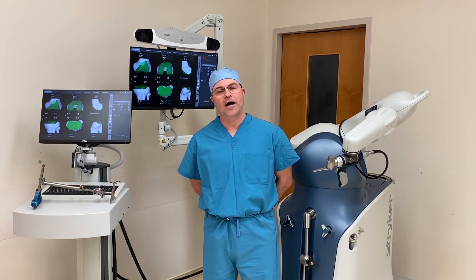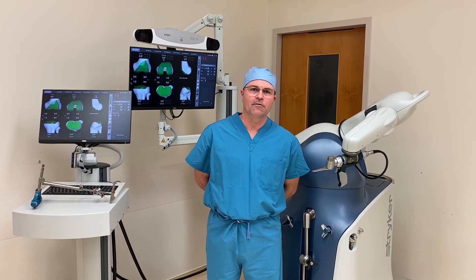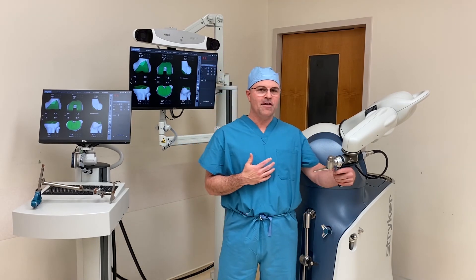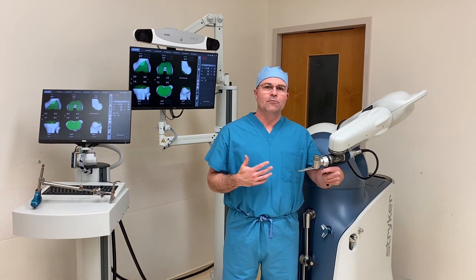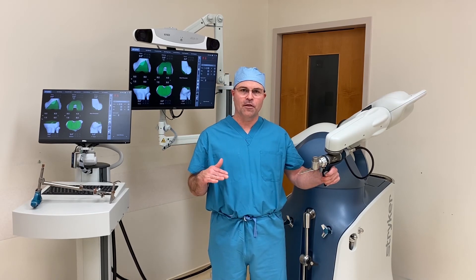With the robot, I know more but I cut less. The robotic arm is a big part of what allows me to do that. While I'm doing the surgery, I have the benefit of this robotic arm, which will prevent me from removing any bone or cartilage that isn't part of the plan.